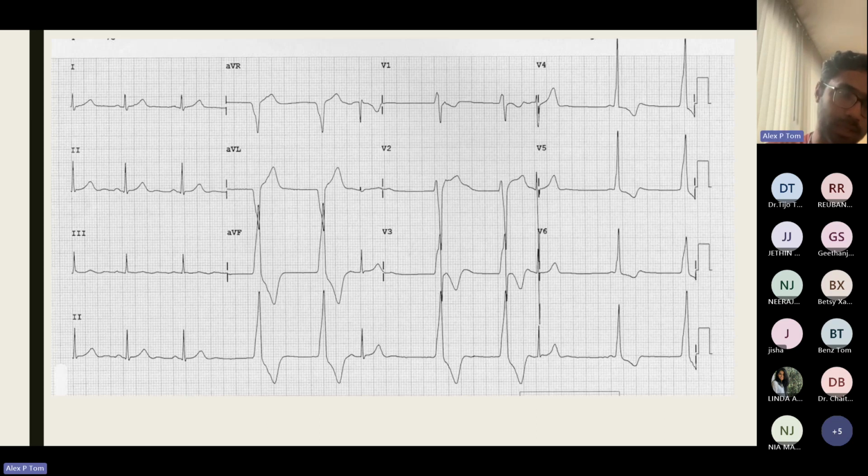So this is a ventricular ectopic one, and that is continuing. You can see 1, 2 ventricular ectopic beats coming one after the other. So that's how it would look. It's just 2 wide complexes coming and then normal ones. And if it's sustained, you can say accelerated idioventricular rhythm. Treatment would basically focus on the underlying condition. Most of these patients would be right after an MI or something like that.